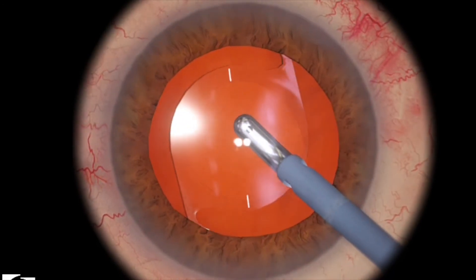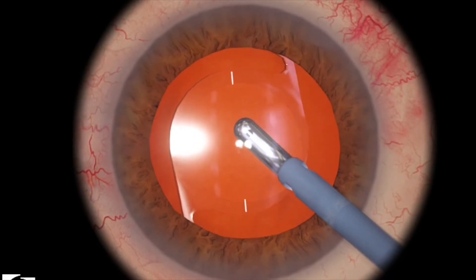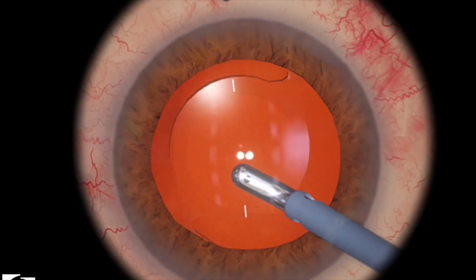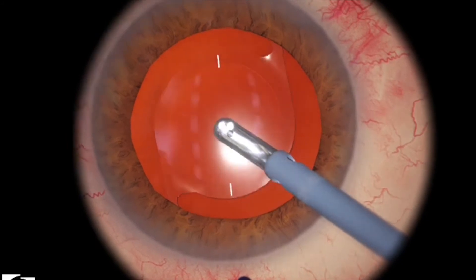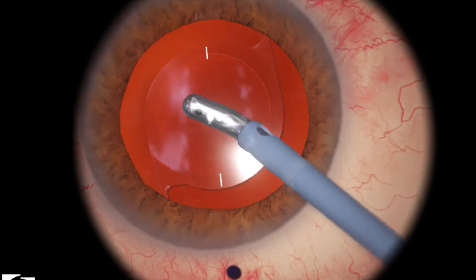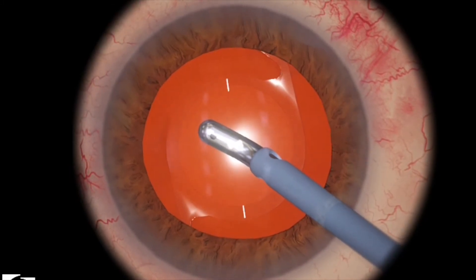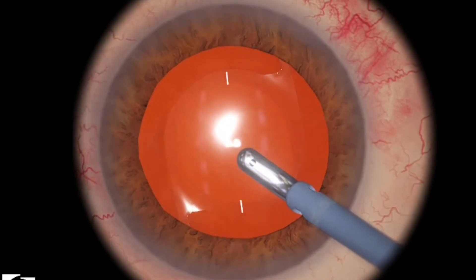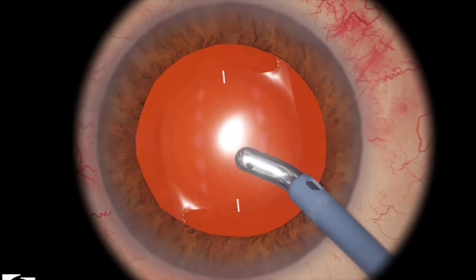Then you can just gently move the lens a little bit, but be very careful as the lens kind of wants to rotate a little bit as well. So in summary, be slow, be gentle. It's very easy to just put the IOL back in place and then proceed in the regular fashion. Be very careful about the lens spinning out on you.